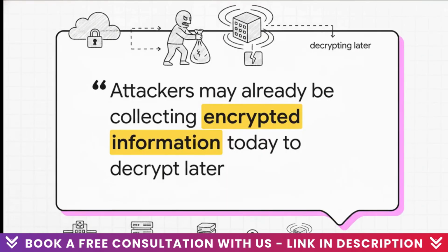This next part is incredibly sobering, but it highlights a massive looming threat. There's a harvest now, decrypt later strategy out there right now. This means attackers are literally stealing encrypted medical data today, just sitting on it, waiting for quantum computing to become powerful enough to break our current cryptographic systems. This is exactly why medical imaging providers must begin implementing quantum-resilient, hybrid cryptographic schemes right now. If you're building a long-term patient archive for 2026, post-quantum encryption isn't some science fiction concept anymore. It's a mandatory requirement to protect patient confidentiality for the decades ahead.